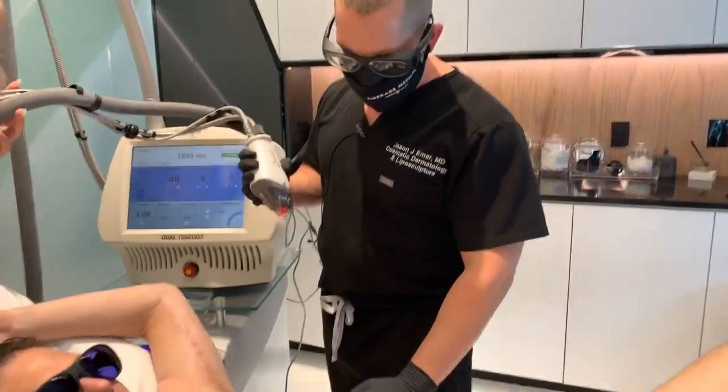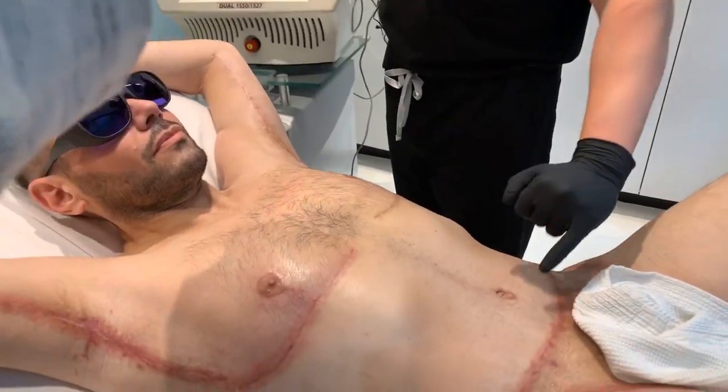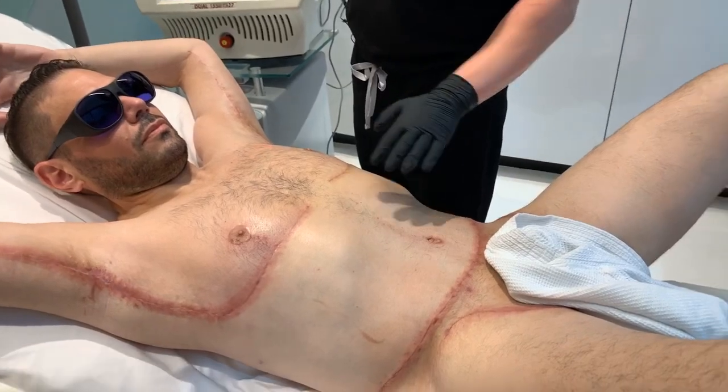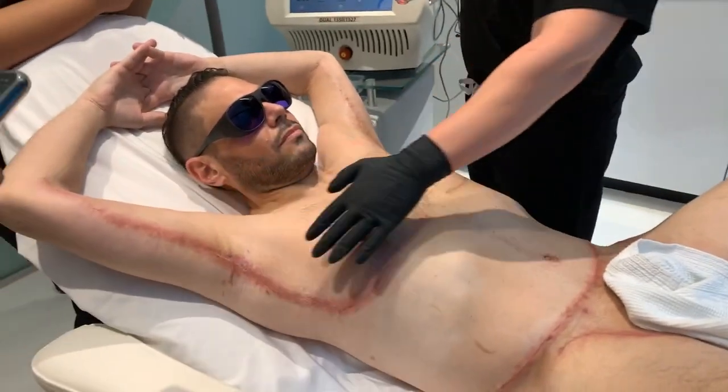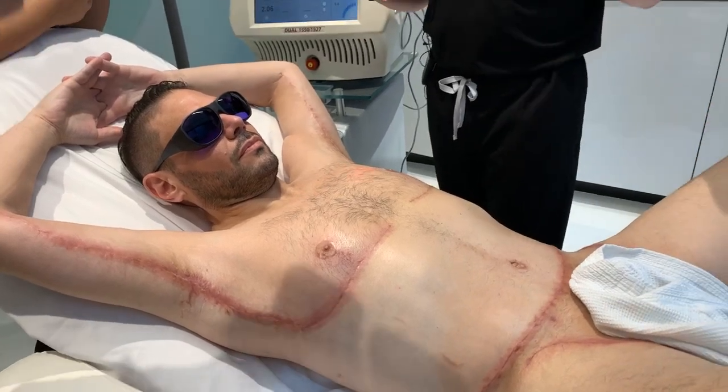So we're now about 6 weeks after you see what we've done. Chest lifting, arm lifting, body lifting, thigh lifting. You can see the scars everywhere. The ones that are red already, those are the ones I've done Fraxel and VBeam on. Those are two different types of lasers.